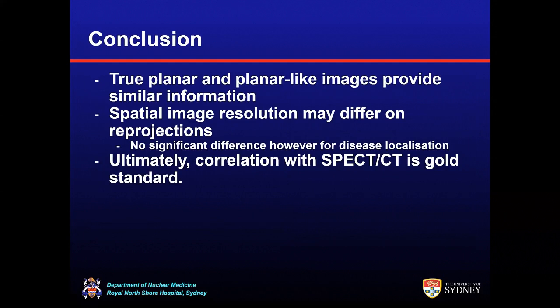Therefore, based on these images, we conclude that the true planar and the planar-like images provide similar information for the interpretation of images for lutetium uptake and prognostication in a clinical context. Spatial image resolution does differ on the reprojected data. However, there was no significant difference for the majority for disease localization. Ultimately, though, correlation with SPECT CT is the gold standard.